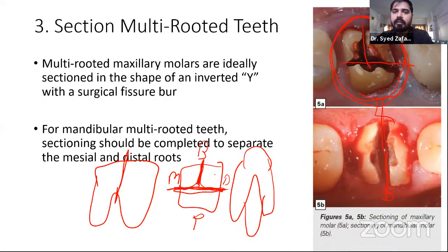This is a very easy treatment. Even if you are not placing an implant and you use this in your normal practice, it will also help you in easy extraction. As I am a surgeon, it usually saves my time if I divide the tooth and remove the roots separately. It is a very easy treatment. It also saves the soft tissue, saves the bone, and is less traumatic.